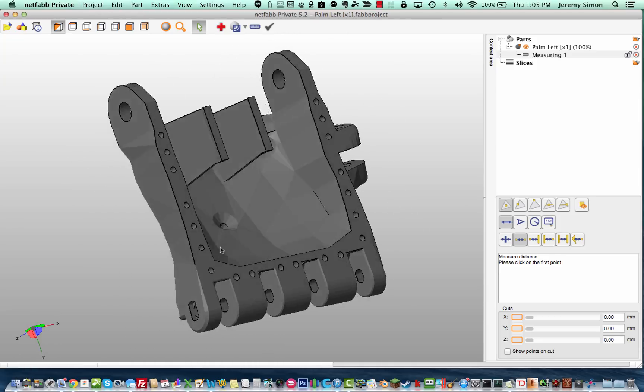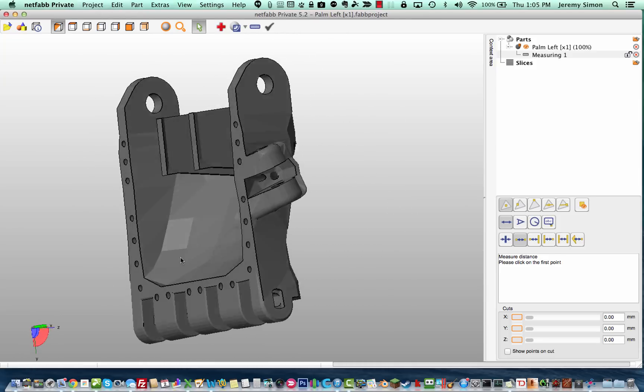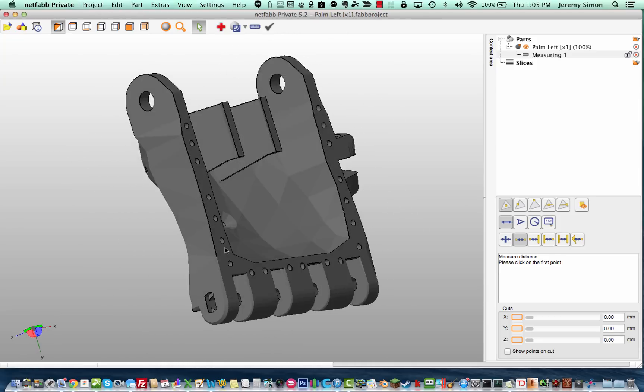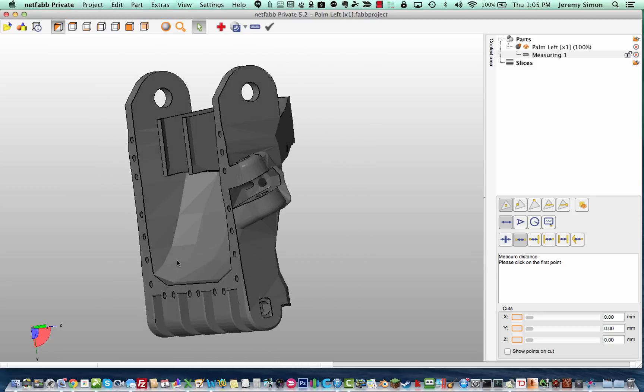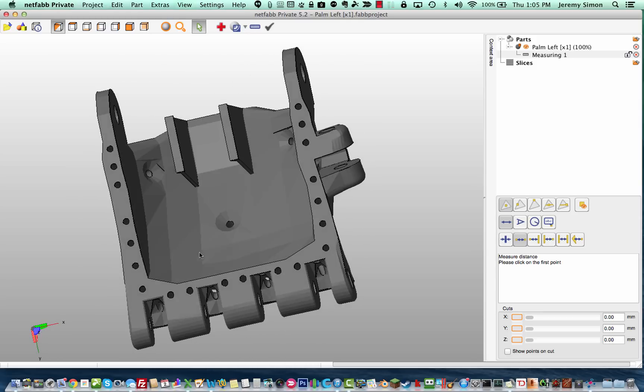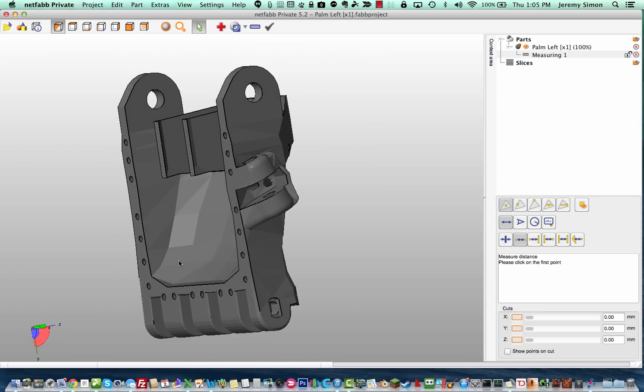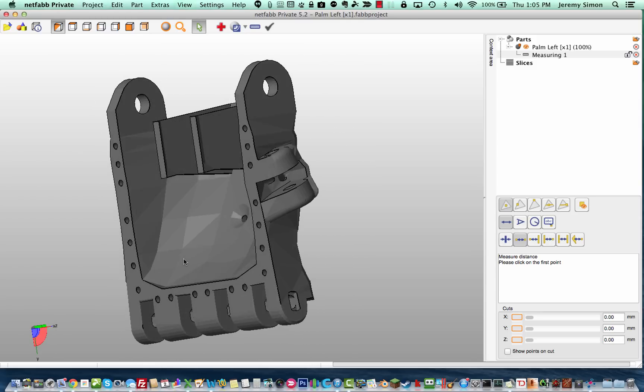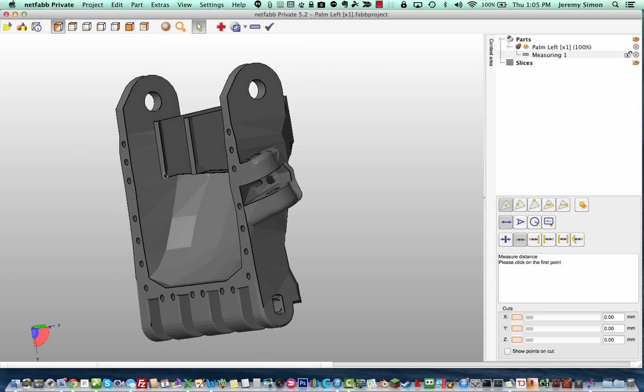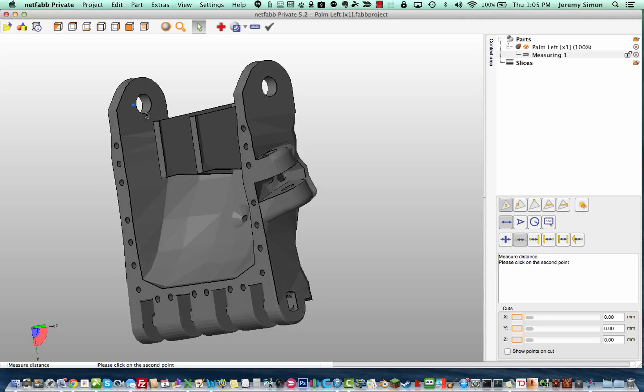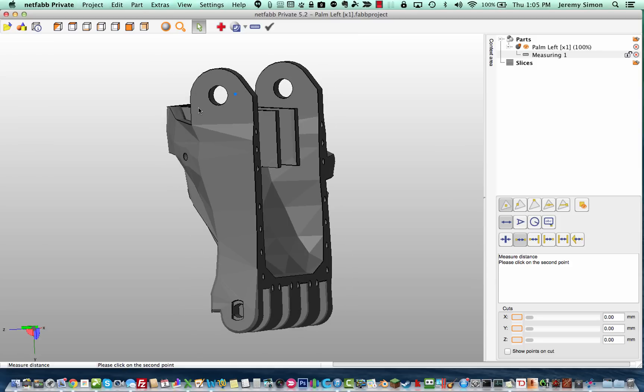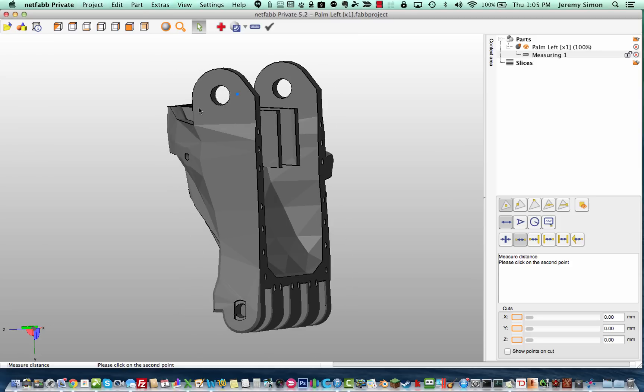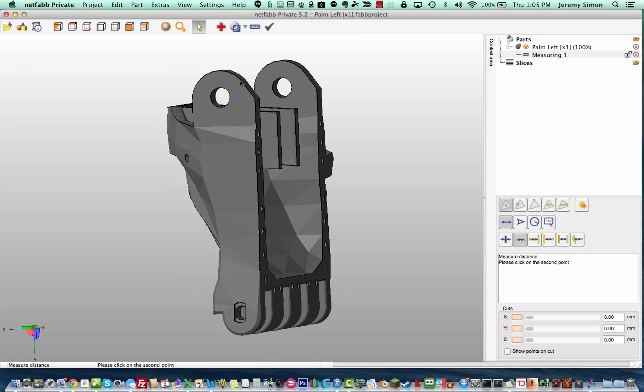Now what I want to do is I want to take a measurement across the inside of, let's say, the wrist joint to see how wide it is from one joint to the other. So I'm going to click on the inside face, and you see it drops a little blue point there, and then again Ctrl, click-drag to rotate it around so I can see the other side.